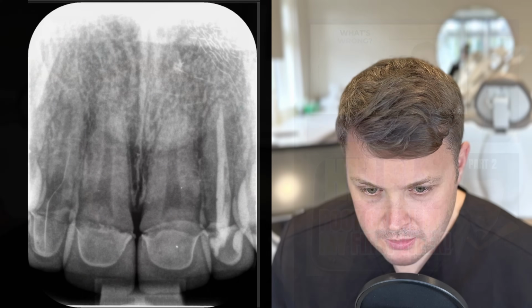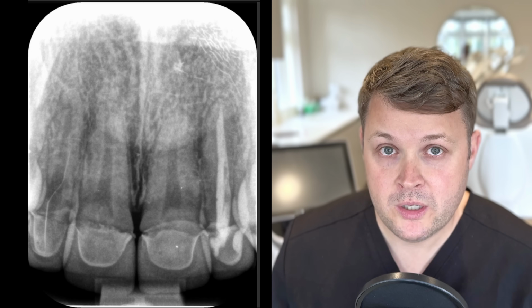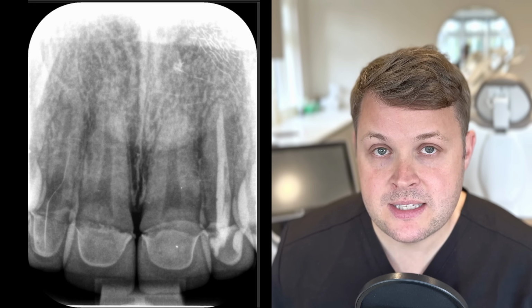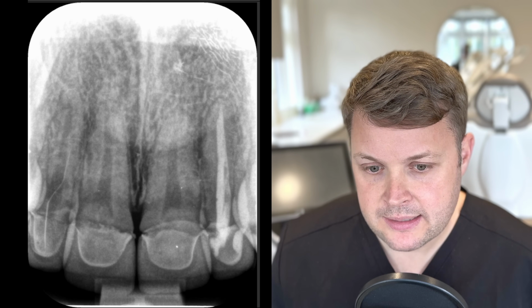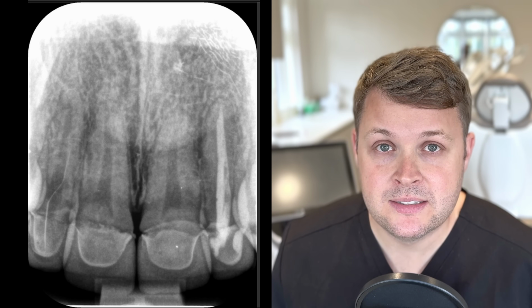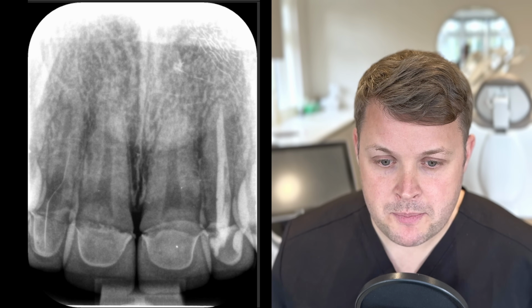So we'll get on with the case. This is a case of an upper central, an upper left one, and this tooth had received some nice aesthetic crowns in the recent past. And the tooth then became symptomatic. The tooth was painful, and there was a diagnosis of irreversible pulpitis / pulpal necrosis in this case. And obviously the patient was consented and she was happy to go ahead with treatment.